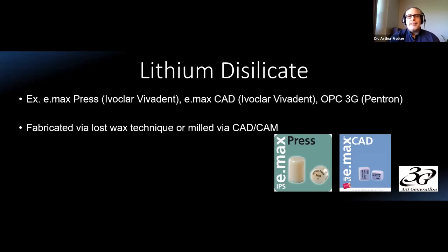Now, the beauty of lithium disilicate over other glass-based ceramics, such as feldspathic, was that you were able to do this via a lost wax technique. For those of you who may remember, and I'm certainly aging myself with this, we used to do gold in our dental school undergraduate training. You would do your wax-up, and then you would do a burnout, and if you were lucky, you got to spin gold and throw flux and make the whole light show. The beauty of gold was that it had very accurate margins, because if you did everything correctly, you would have a one-to-one representation of your impression in the restoration itself. The problem with things like feldspathic veneers is that you would rely sometimes on the resin cement and your adhesive protocol to ensure good retention and to fill in any voids or gaps.